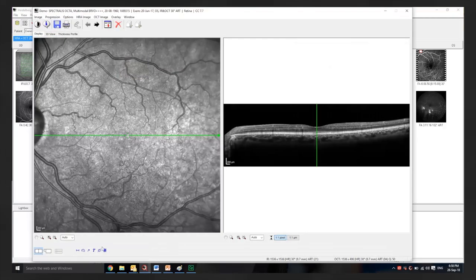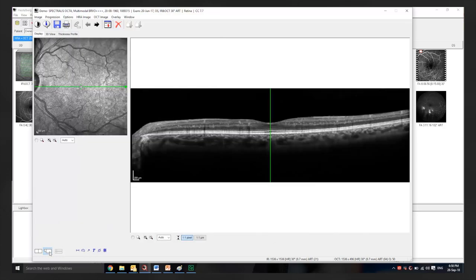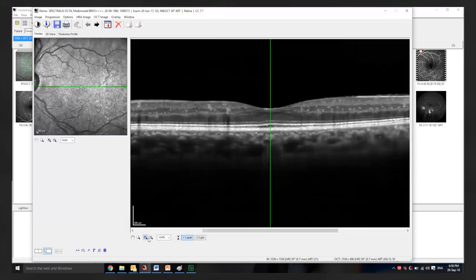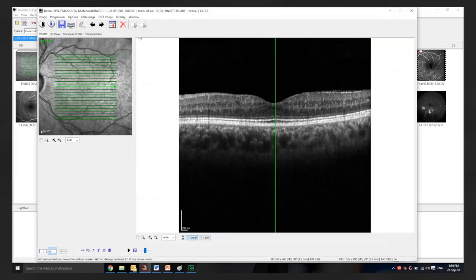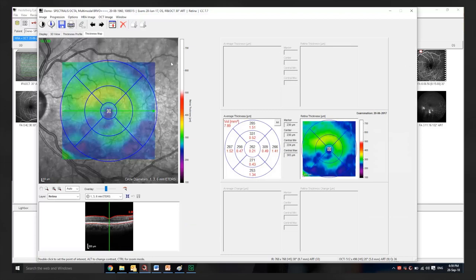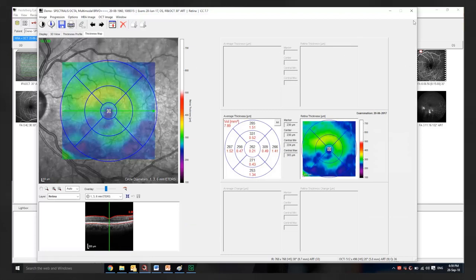Analyzing structural OCT and a retinal map would be important in identifying thickness. Thickness is not information that would be gained from OCTA. Structural images may provide surrogate information about breakdown of a blood retinal barrier or atrophy.